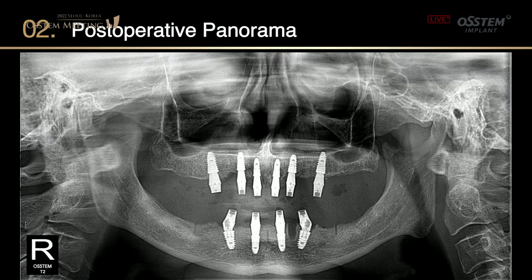Panorama image is available after surgery. So can we see it? Post-op panorama. What do you think?